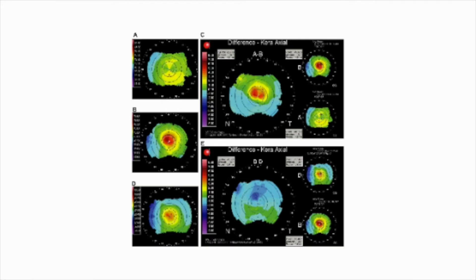We used a wavefront guided treatment to reverse the Suprafor effect. In figure D, you will see that the treatment became more on-center and there was less steepening. Figure 1C and 1E show the difference maps from pre-Suprafor to after Suprafor, and pre-Reversal to after Reversal. We also documented the higher-order aberrations and saw the changes through each stage.